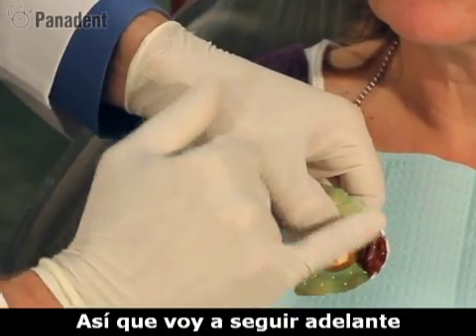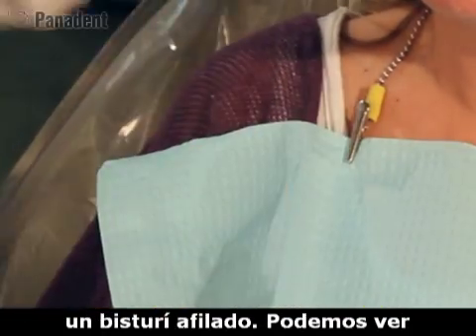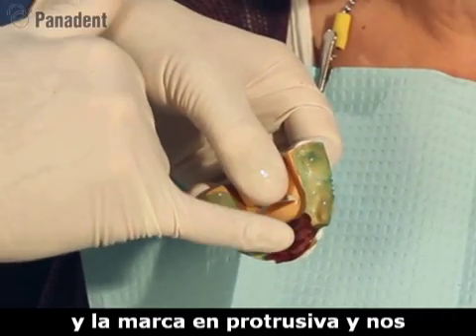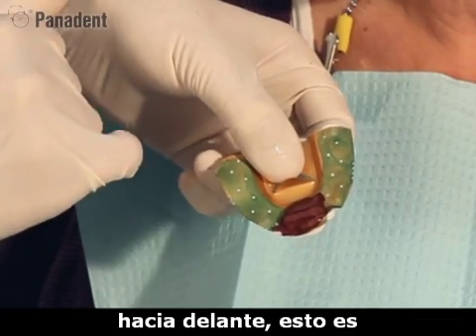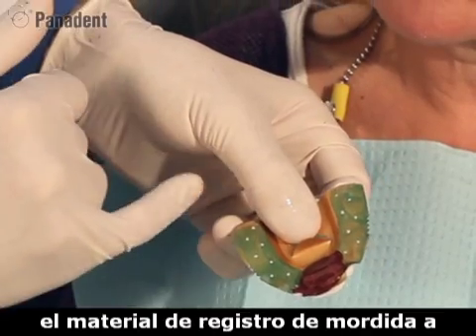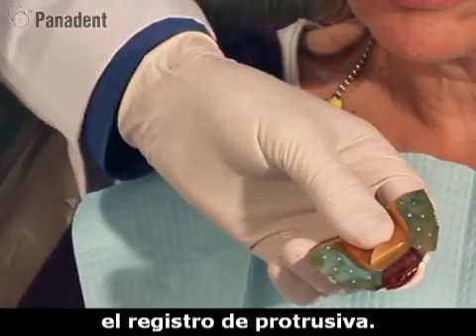So I'm going to go ahead and chill this with cold water and shave this back a little bit with a sharp scalpel. Again, now we can see that I cut this back. We can see both the centric index and the protrusive index. And we like to go between 5 to 7 millimeters forward, which this is approximately 5 millimeters. So we're ready to add the bite registration material to the posterior area to finalize the protrusive record.